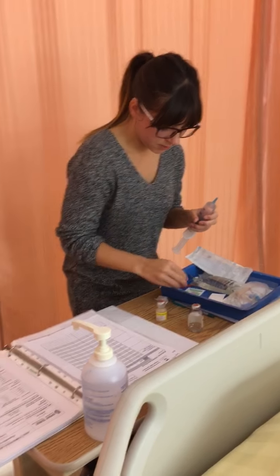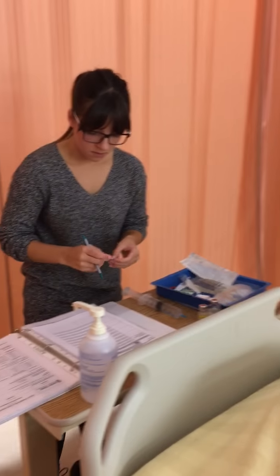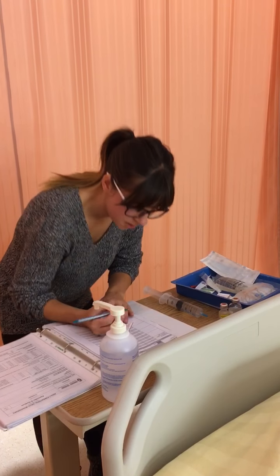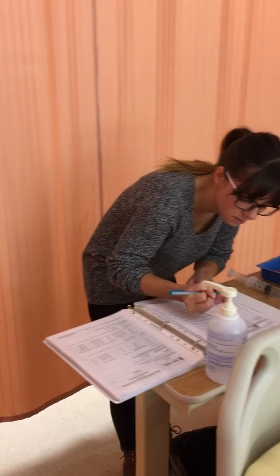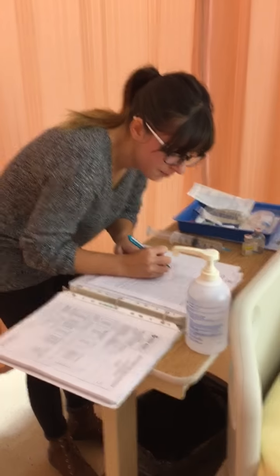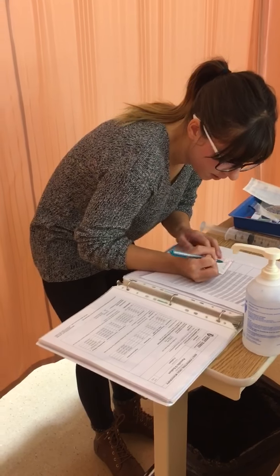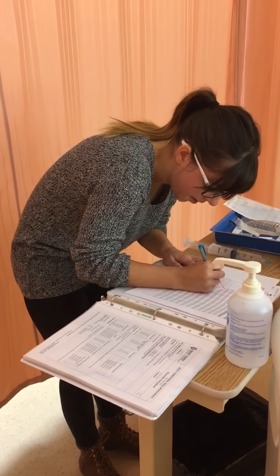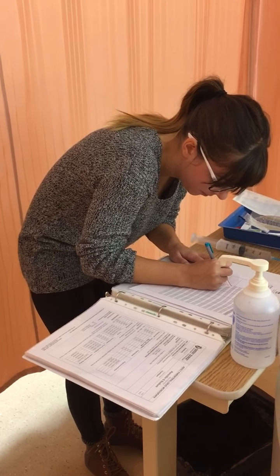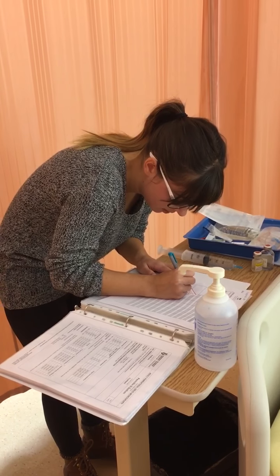Okay, so I'm going to put the med label on the syringe now. I'm just going to refer to my mark here. We want to make sure that we have the patient's name on there, so Pablo Pitts, we're going to do initials. The drug name, which is penicillin G. The dose, which is 4 million units.